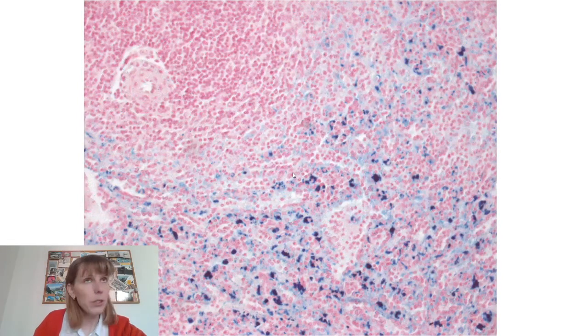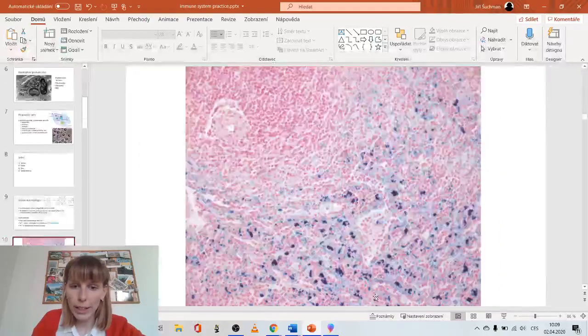We don't have, on Histology Guide, a slide of spleen with this type of staining. So this picture that you will have in the presentation is basically what you need to remember. We will cover the spleen later, and in this part of the spleen you can see many accumulations of dark blue color. These will be the macrophages that ate a lot of red blood cells, have hemosiderin in them, and stained with the Prussian blue. So this is how the Pearl's reaction would look.